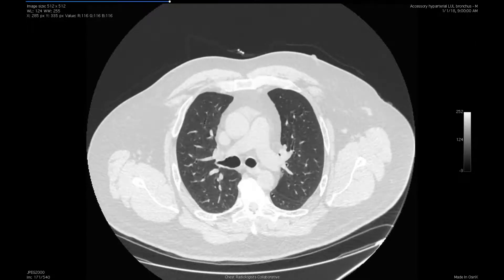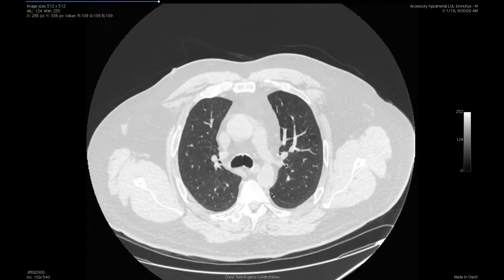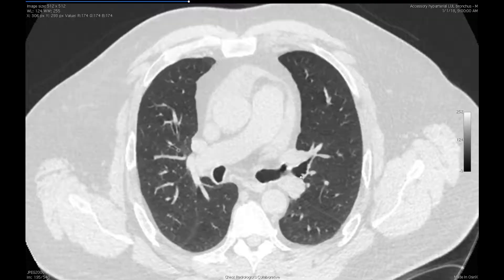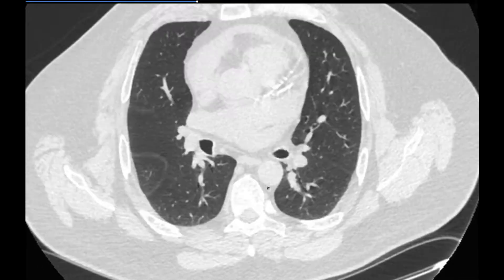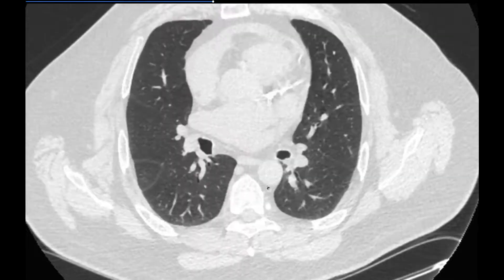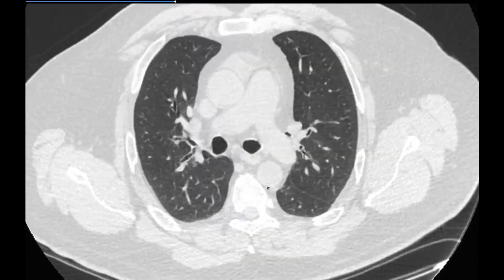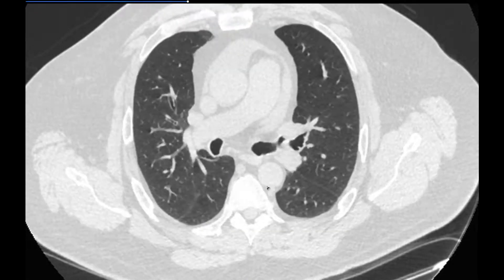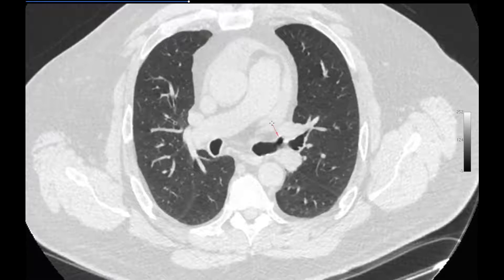I've seen a variant very similar to this a couple of times, and it's often associated with an abnormal fissure. I've seen them called in some of the older literature as a left tracheal bronchus, which clearly it isn't because it doesn't arise from the trachea. And I think that explains why sometimes you hear about the tracheal bronchus usually occurring on the right, because I don't know if anyone's ever seen a true left tracheal bronchus.